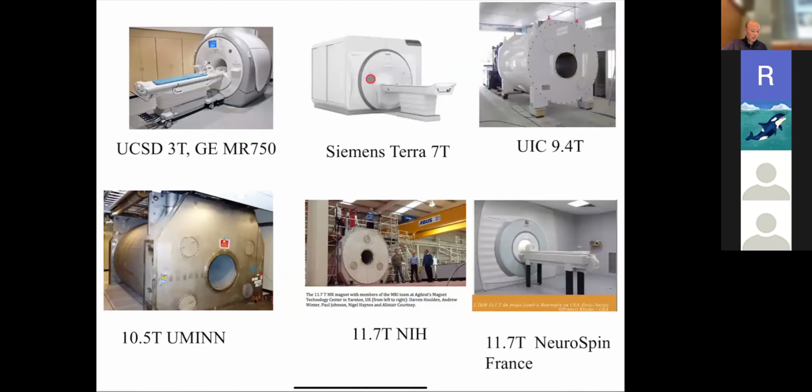Okay, so typically for the main magnet, we use Tesla to say how strong the field is. So 3 Tesla is now sort of standard for clinical imaging. If you're at a premier site like UCSD, most of our scanners here are 3 Tesla scanners. We do have some lower field scanners. So if you go to the hospital, then you'll most likely get scanned on a 3T scanner.